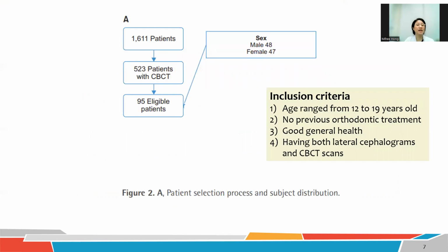Diagnostic recordings of 95 adolescents out of 1,611 patients were obtained. The inclusion criteria were age ranged from 12 to 19 years old, no previous orthodontic treatment, good general health, and having both lateral cephalograms and CBCT scans with a clear visualization of craniofacial structures. The sample was distributed into two sex groups.